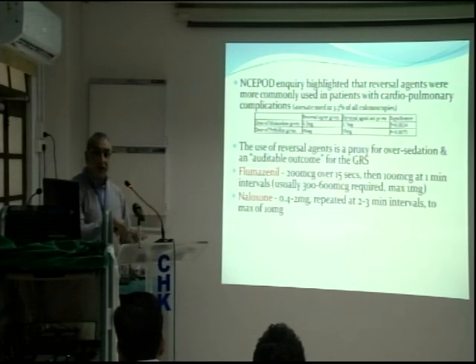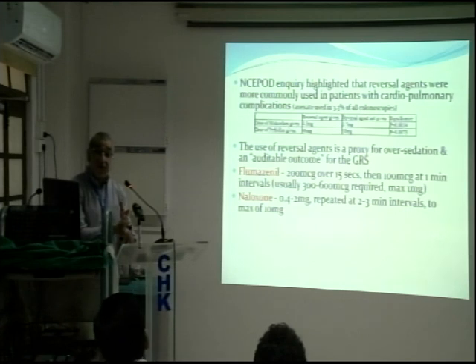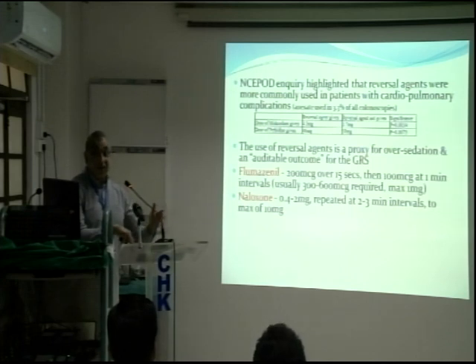The nurses fill out an adverse incidence form with it, and it's put against my record. That doesn't stop me from using it if it's a life-saving procedure, because if the patient goes off, irrespective of what my record says, I have to save that patient's life, but it will be against my record, which means that I have to use minimal doses of sedation.